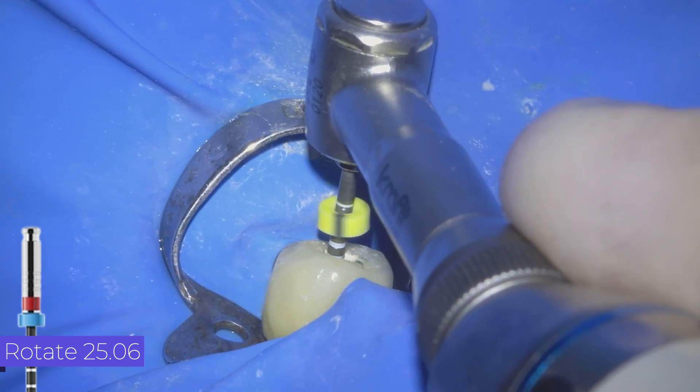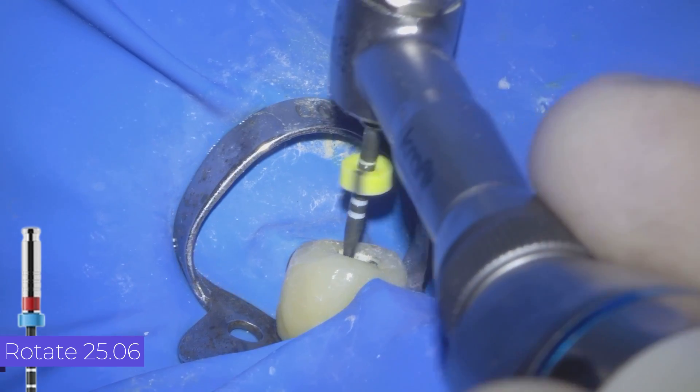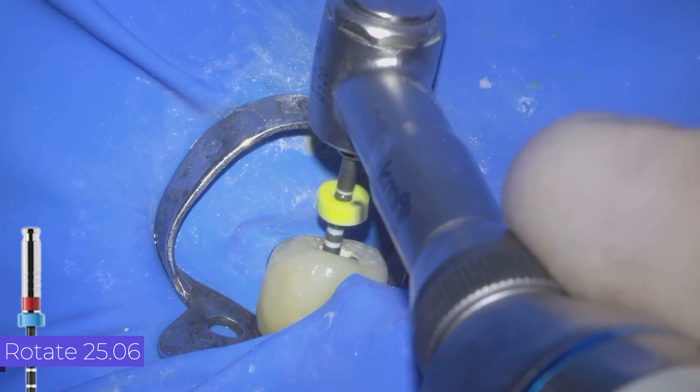After irrigating, we will perform the apical gauging.